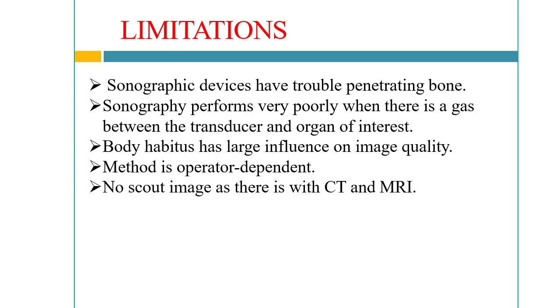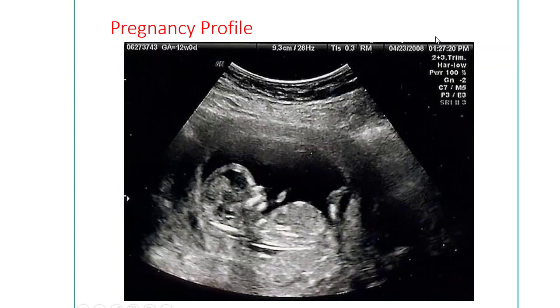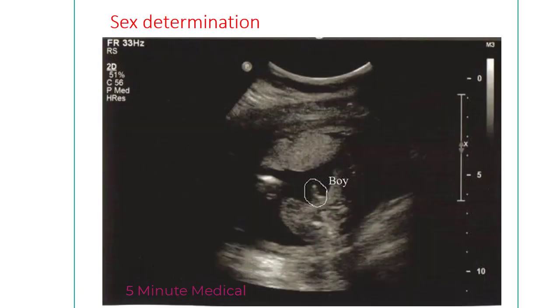Now we will see ultrasonography images of common diseases. This is a pregnancy profile showing a baby; it measures the length of the baby and other pregnancy parameters that can be measured by ultrasonography. This image shows sex determination — here a male sex baby is identified, which can be diagnosed by ultrasonography.